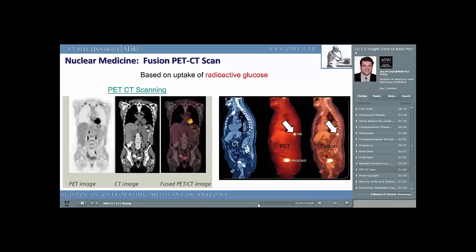However, if the patient is given such a huge load of radioactive glucose, the body, of course, during the scanning time, won't be able to use all of that glucose, and by default, it has to be excreted somehow. Be careful interpreting this as diabetes, because it could just be a normal finding of the massive glucose load the patient was given to try to find any metastatic lesions.